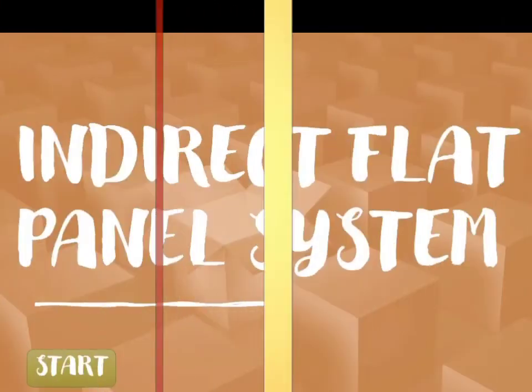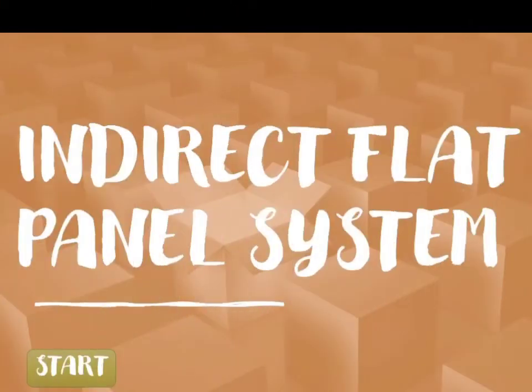Hi everyone, so for today's topic, we are going to talk about the indirect flat panel system. Before we go further into the discussion, I would like to briefly explain what exactly a flat panel system is. It is an image receptor that is used in digital radiography systems. It converts X-ray light into electrical charges, which then produce an image in digital form, which is a matrix of pixels, each with a numerical value. Finally, a digital image will be displayed on the monitors.